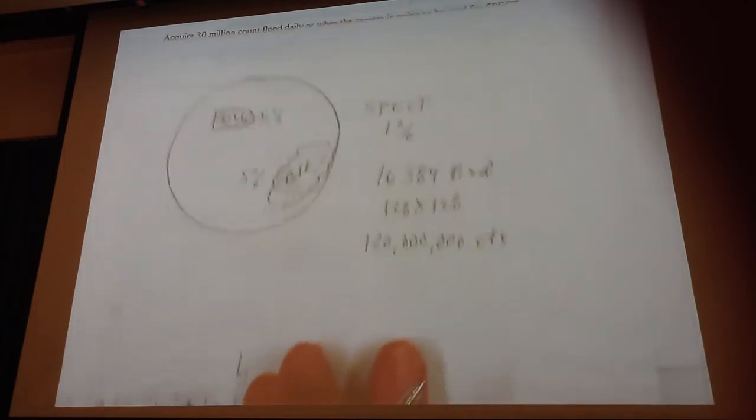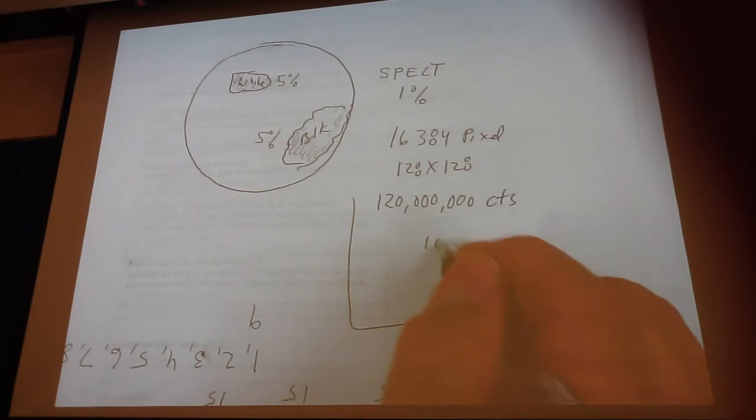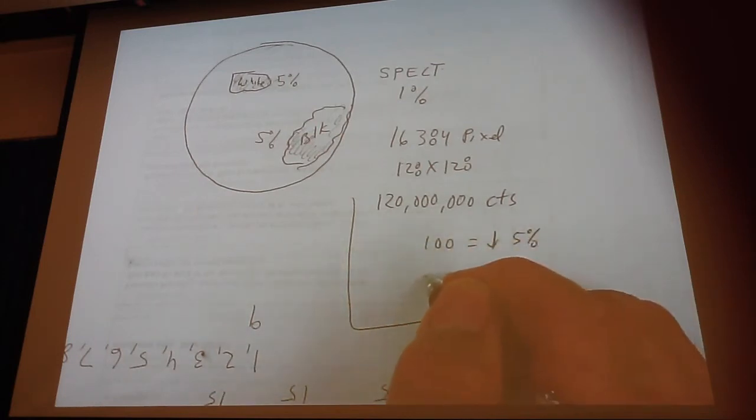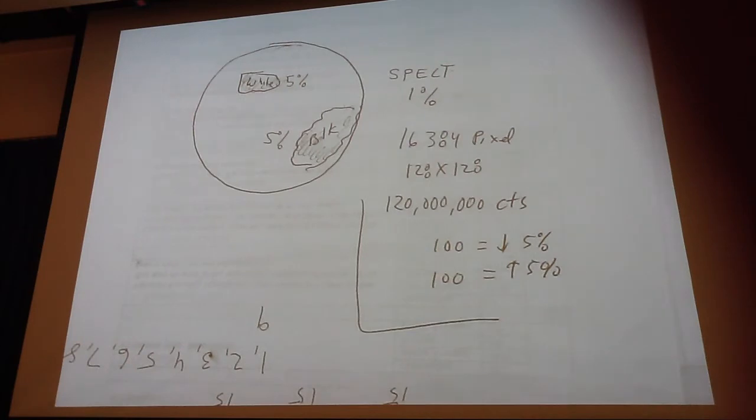Okay? And it will say that, you know, 100 have less than 5% and 100 have more than 5%. So it'll give you a breakdown in the number of pixels that were detected to be out of range. Okay. As I said, either you have not seen this or they haven't done this, but please believe me that it exists. Okay?